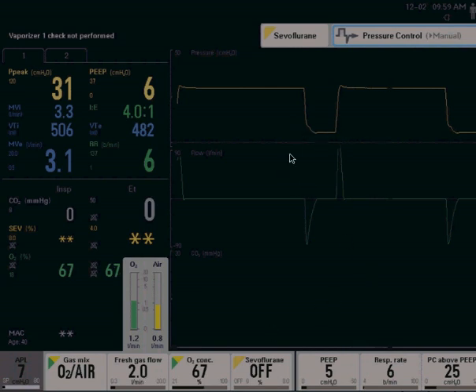Now the main difference here from a traditional ICU ventilator is the expiratory phase, which would be considered the release phase in APRV. With airway pressure release ventilation, this release phase is very short. It's usually under 1 second, anywhere from 0.75 to a half a second, even down to a quarter of a second, to optimize lung recruitment and prevent a de-recruitment phase. As you notice with this stiff compliance, the lung completely empties and the volume returns to baseline for the flow. So there is no auto PEEP generated at all.